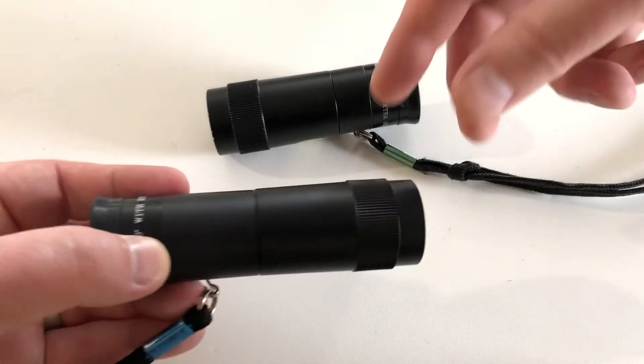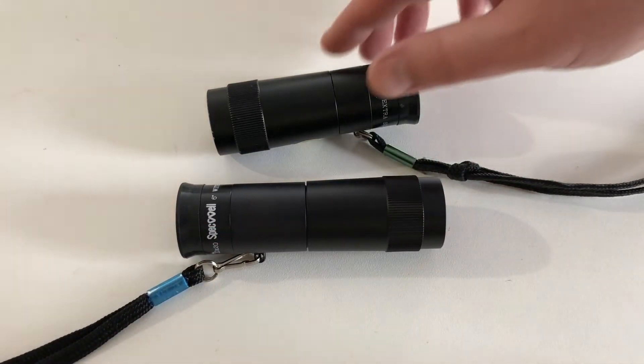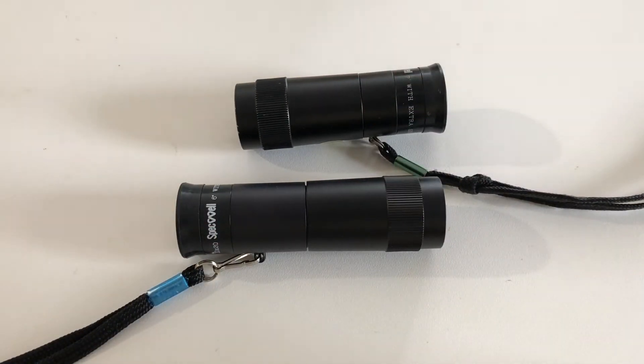Here we have the 8x compared to a 10x monocular. You can see the 10x is longer. This does allow objects further away to be closer, but the viewing area inside the telescope does become smaller.